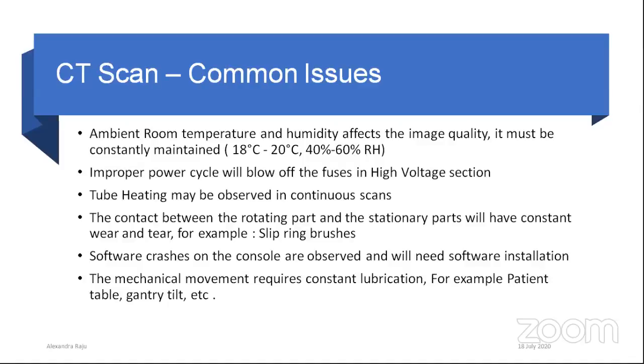And the next is software crashes on the console. Sometimes the software will not work properly, so we have to reinstall the software and then perform the scan. The major issues happening with the CT are software issues. So next slide.